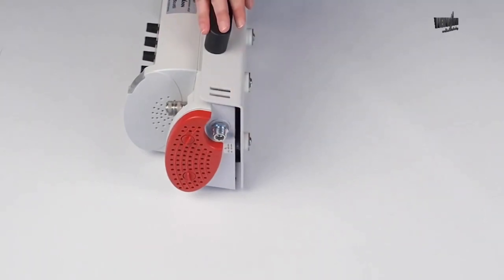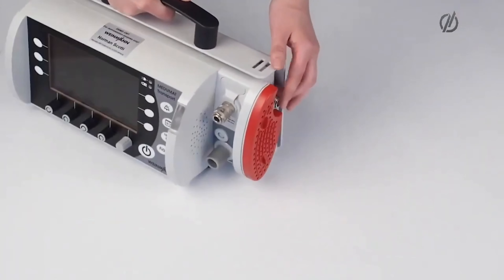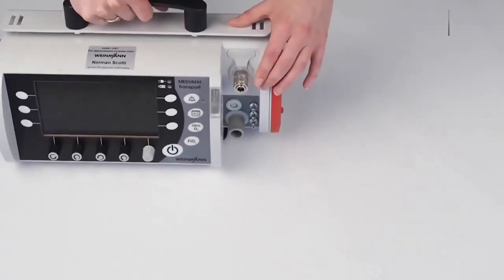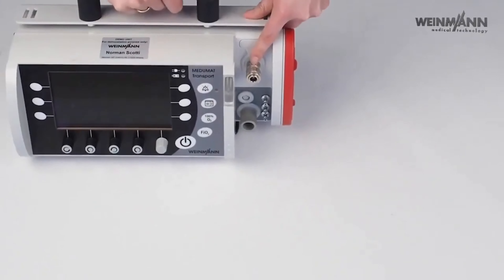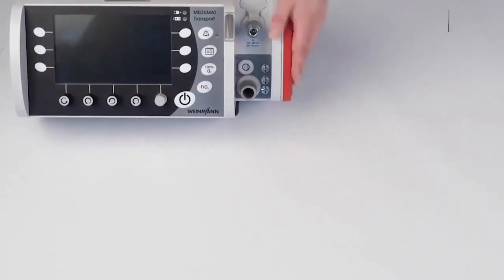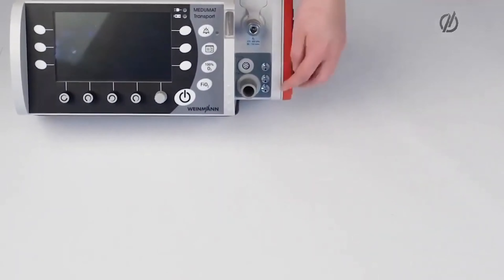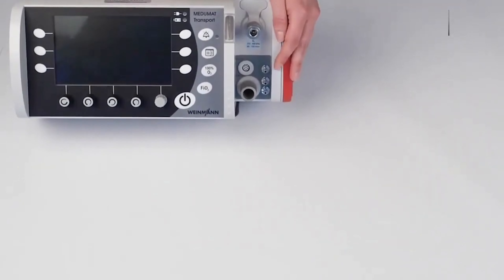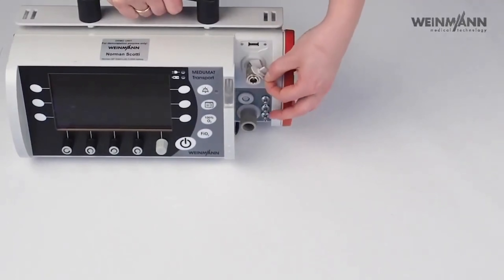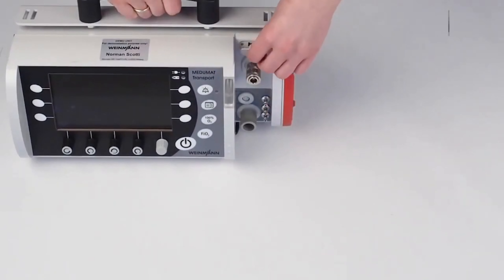Gas comes from the oxygen bottle or from the wall mounting. We have two gas inlets here: one at the side via screw, and one is a fast coupling which you can also use. We have here our connection for the ventilation hose, for the flow sensor cable, and for the so-called measurement hose system. I will show you how to connect everything later. Here we also have our little USB port where you can plug in a USB drive to read out data.